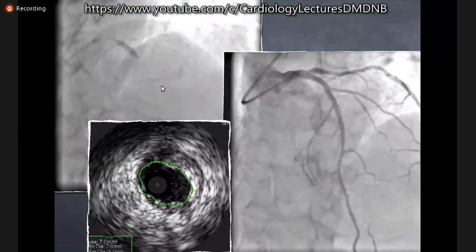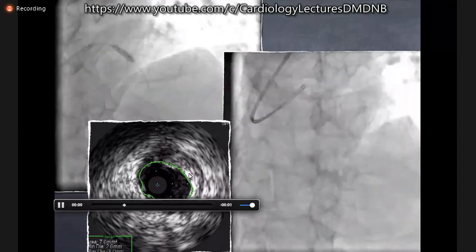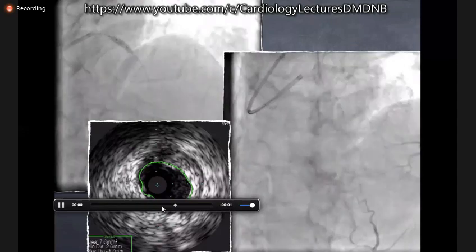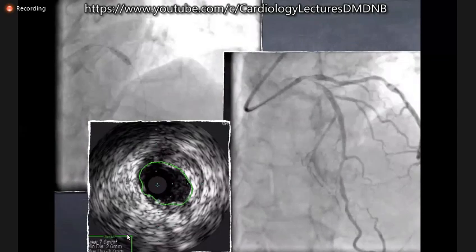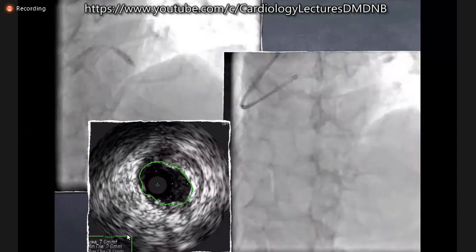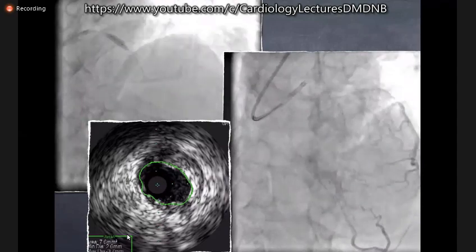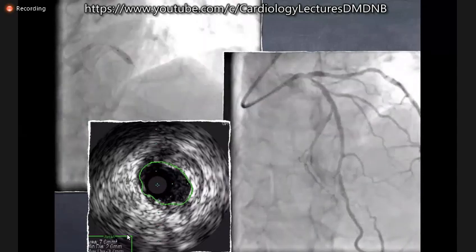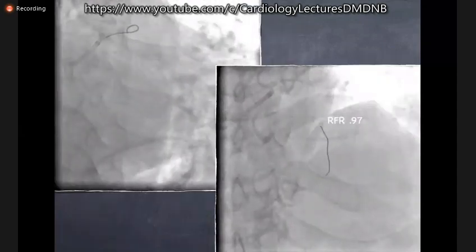Following post-dilatation with the 3.5 millimeter balloon, we did an IVUS evaluation. The lumen area was not so good. So we went ahead with a 4 millimeter post-dilatation, and you could see that the minimal luminal area was still 7.6. It made me feel that there was a little bit of under expansion. Probably there was a fibrotic lesion and calcification. I should have gone with a cutting balloon or a scoring balloon for better lesion preparation, but I didn't do that. So I ended up with a minimal luminal area of 7.6.